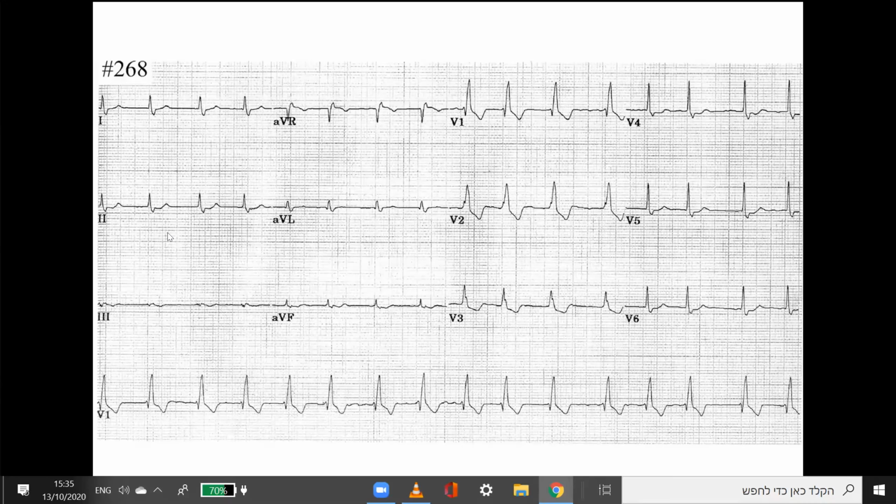Okay, I started. I'm not sure which one you gave me. Was it 268? That's fine. I never saw this ECG. I was waiting for it, but now I got it. That's great. This is yours. And you have very good company, so a lot can help you. Give me just a second.